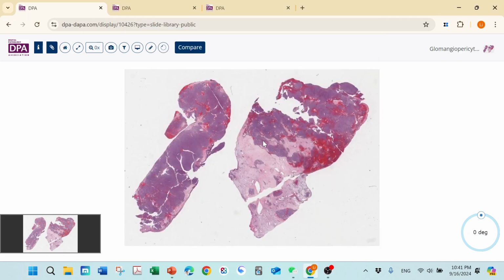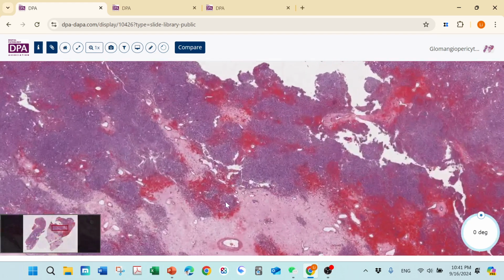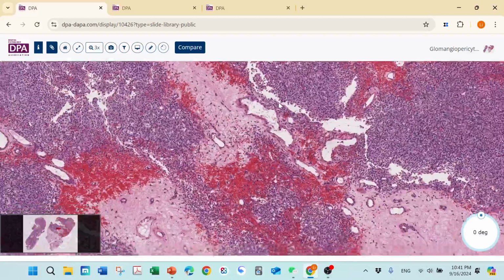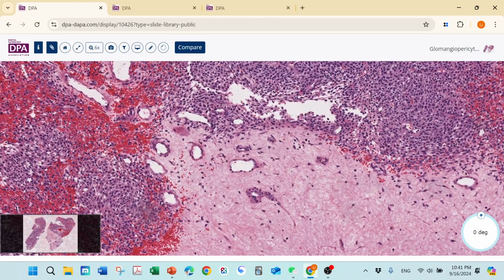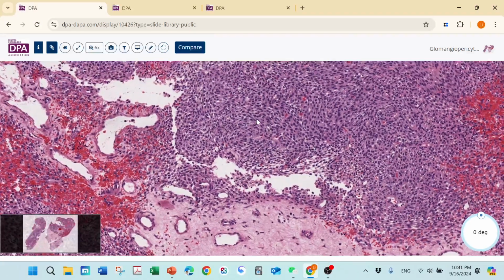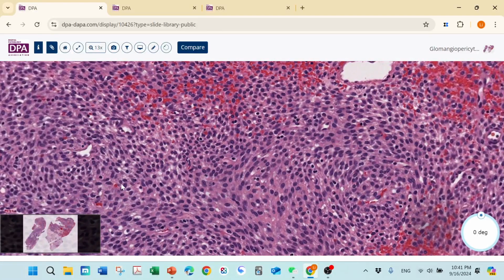So this glomangiopericytoma, let's see some characteristic finding. We have some edematous area, some hypercellular area, really bloody. And then let's see the characteristic vessel. This hyalinized blood vessel wall. See, hyalinized blood vessel wall, not like angiofibroma. Kind of hyalinized blood vessel wall hugged by this monotonous cell. These cells sometimes they can form this whirling structure. Really bloody, they look really identical.